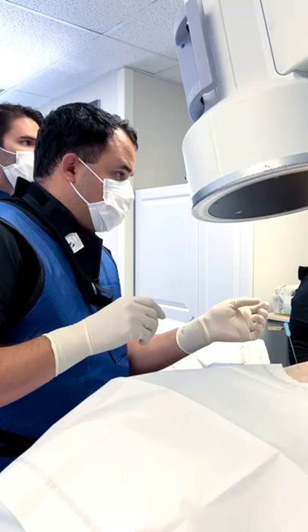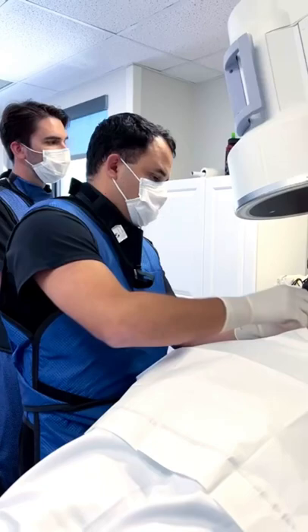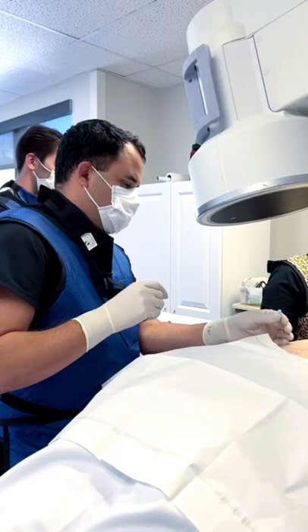This video shows us doing medial branch blocks in a patient with axial lower back pain. With these medial branch blocks, we're able to de-innervate the nerve that goes to the facet joint that's causing their pain, worse with extension and rotation.